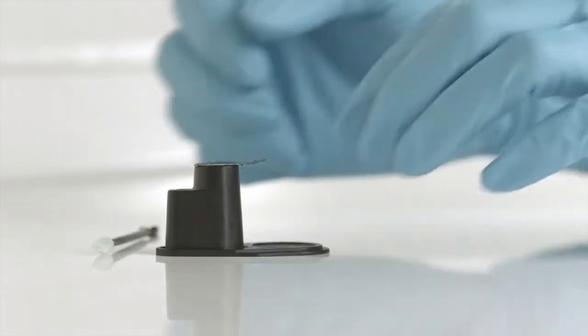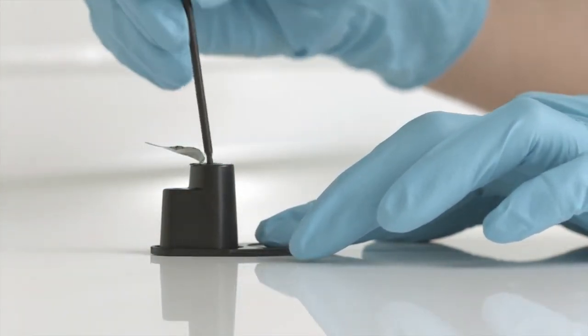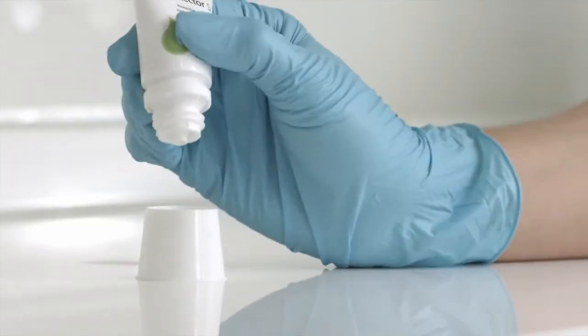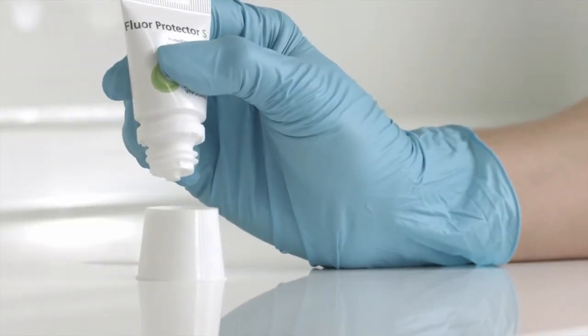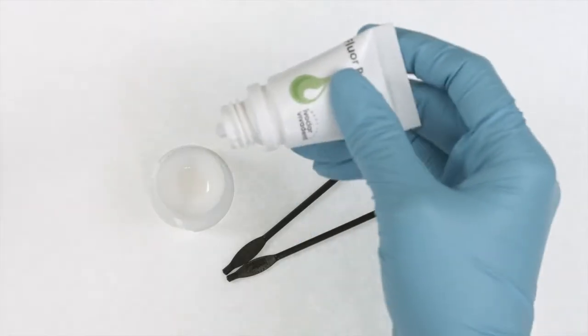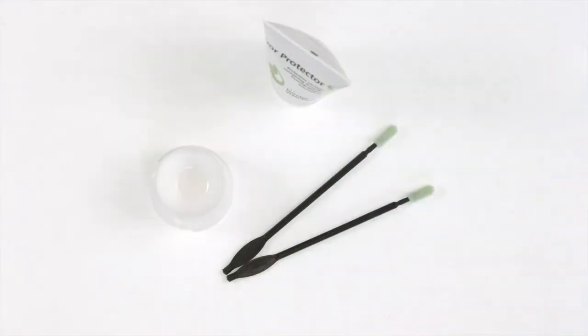Remove the required quantity of varnish. It is recommended that you briefly dip the applicator into the fluid once if you use a single dose unit. The Fluor Protector S tube enables you to dispense the material exactly in the desired quantity. Only use as much varnish as you really need to prevent residual material from drying out in the dappin dish.